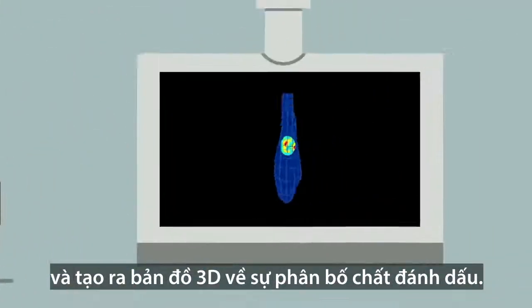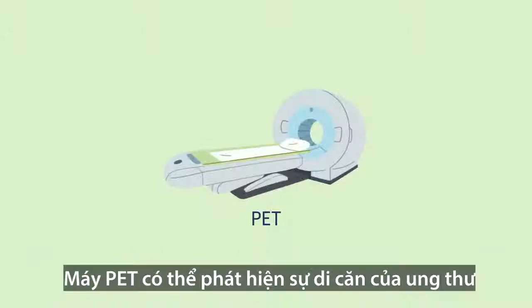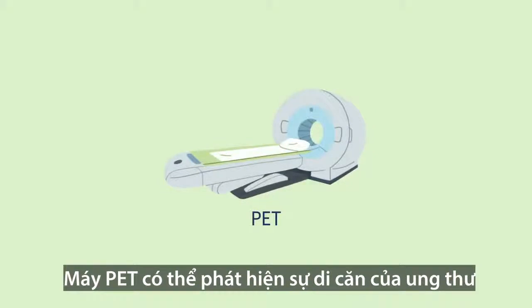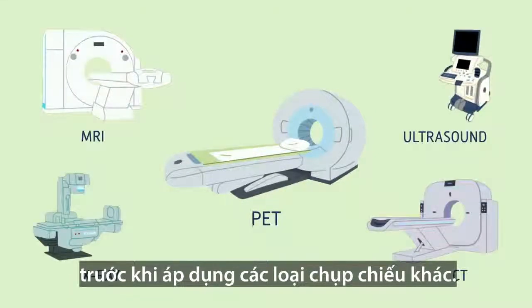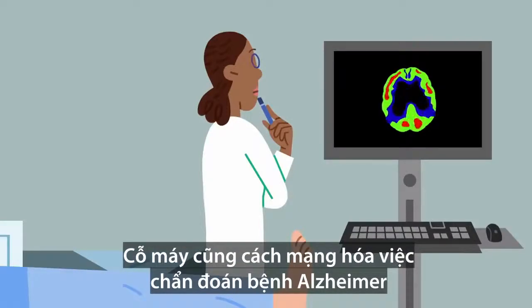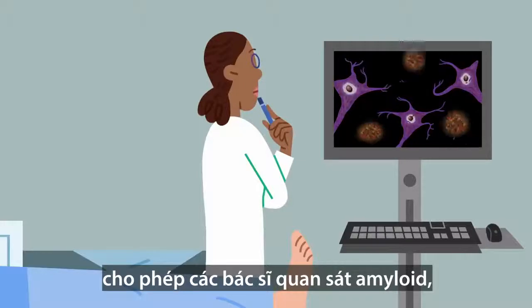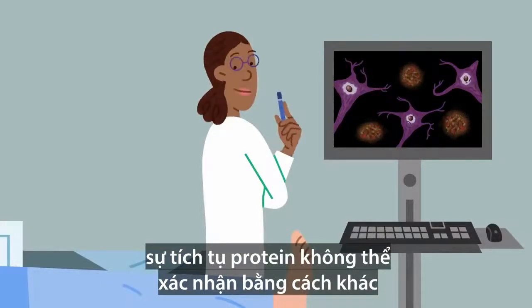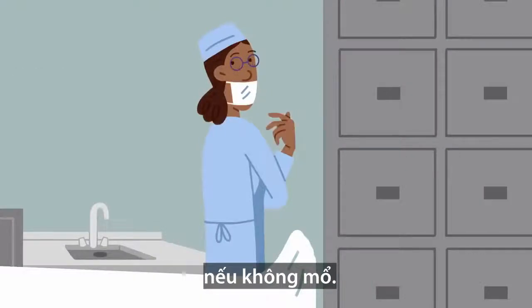The software in the scanner uses those detectors to estimate where inside the body the collision occurred and create a 3D map of the tracer's distribution. PET scans can detect the spread of cancer before it can be spotted with other types of imaging. They're also revolutionizing the diagnosis of Alzheimer's disease, by allowing doctors to see amyloid, the telltale protein buildup that otherwise couldn't be confirmed without an autopsy.